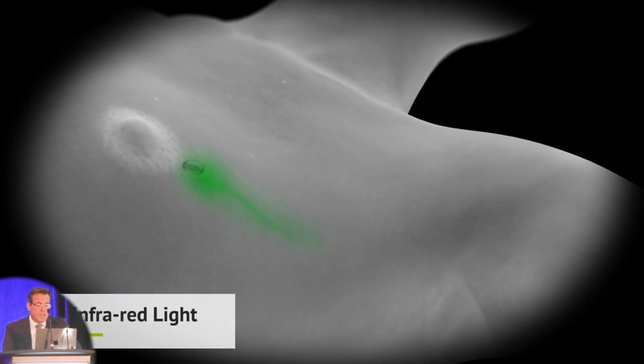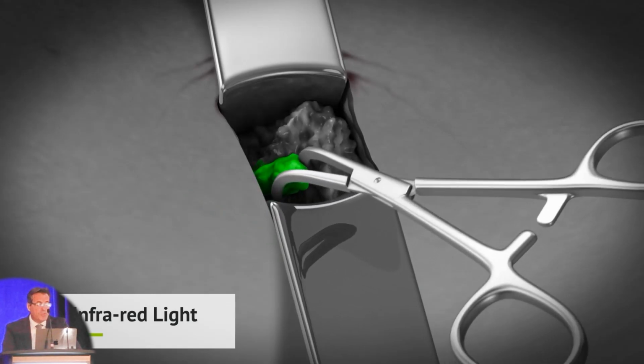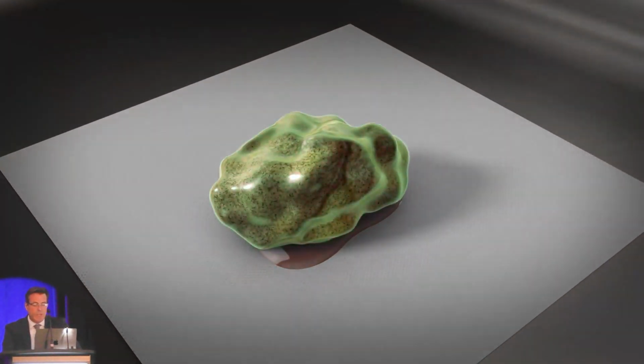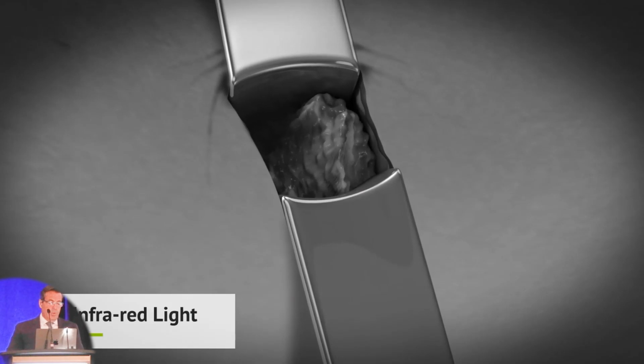We activate the camera and see the lymphatic pathway beneath the skin. When the flow halts, we make an incision, as you can see there, and observe the Sentinel node in fluorescent light. After excising the node, we clear the surgical field to assess if there is a second or third Sentinel node.